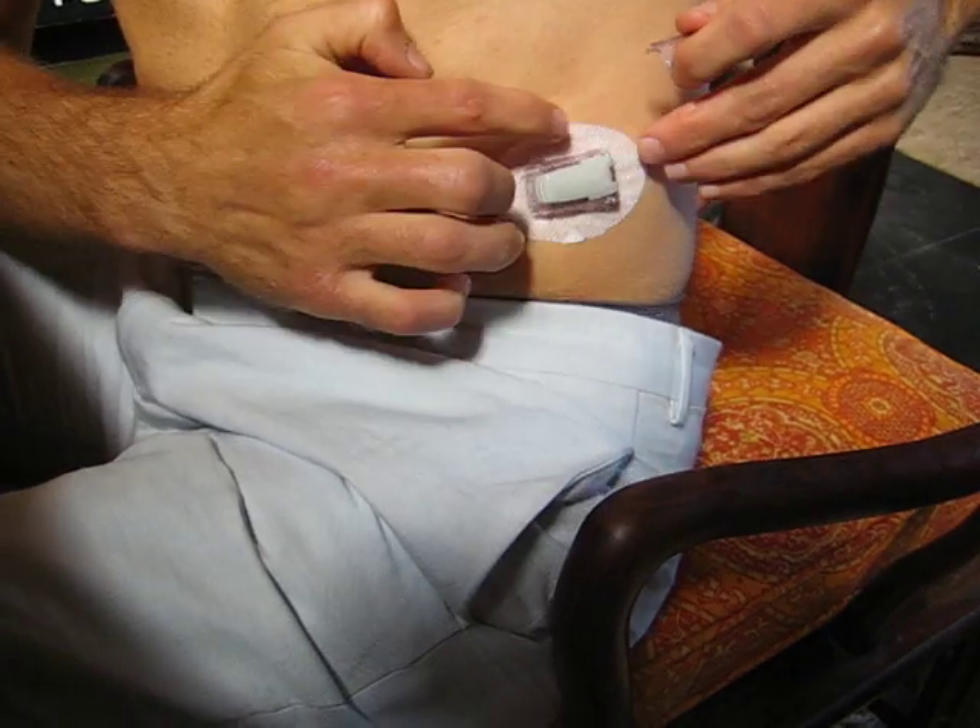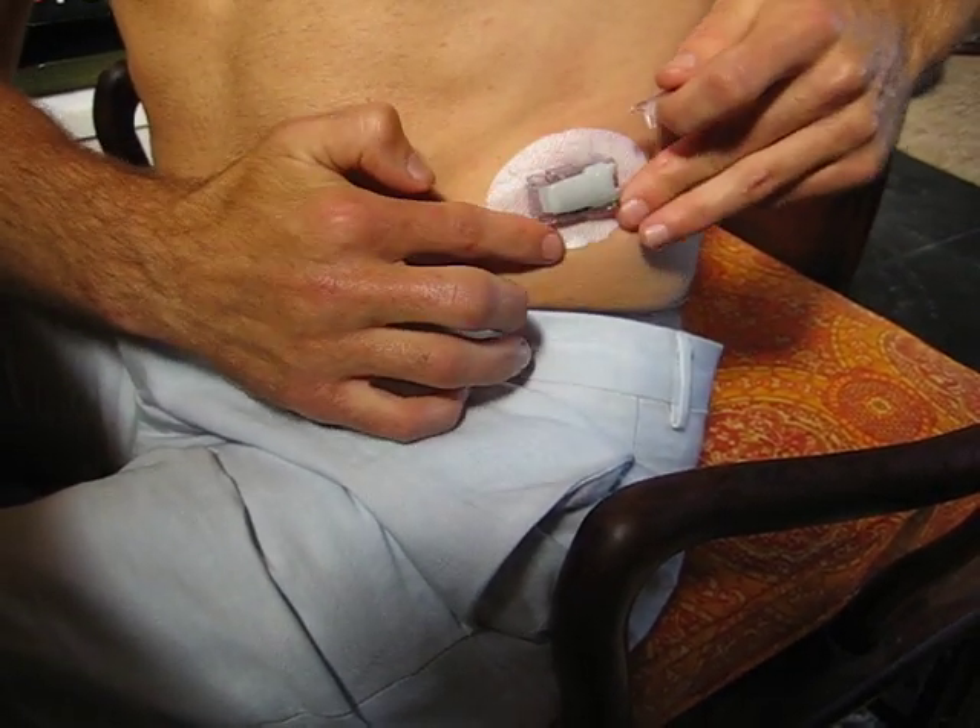Done! Boom. Look at that — that is as bad as it's going to get. Holy crap. So what do you say about that? My first implantation! All right, thank you.